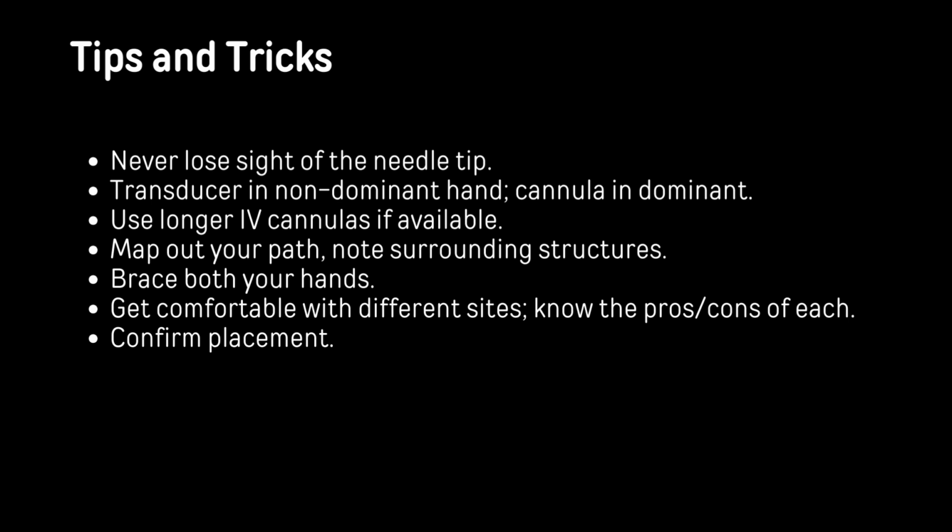Different sizes and the confirmed placement, I can't stress this enough because every year somewhere there's a line that someone places in the artery. Okay. And once you've dilated, it's too late. Okay. And there should be no excuse to confirm that it's in. Okay. So to confirm it, before you dilate, once you've got the wire in, then you take the probe again and you look and see, is it in the vein or is it in the artery?